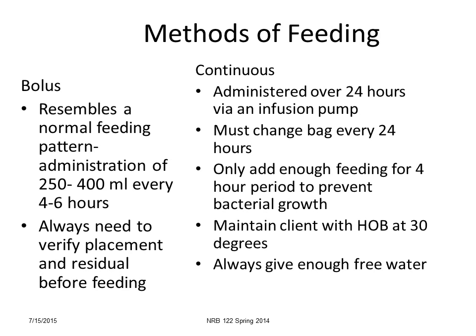A continuous feeding, however, is small amounts delivered over 24 hours via an infusion pump. It's only over the past 10-15 years that we've been using feeding pumps. Typically, we used to just run them like an IV drip, and then we had many problems where it would speed up. So now they are also given via a pump. And there's certain protocols every institution has. The entire feeding apparatus needs to be changed every 24 hours, and we have to maintain the head of the bed at 30 degrees.